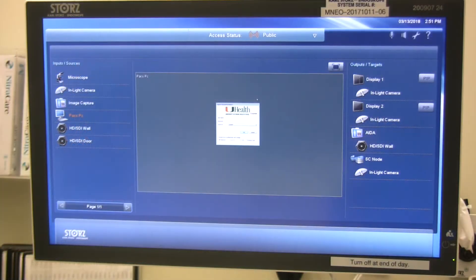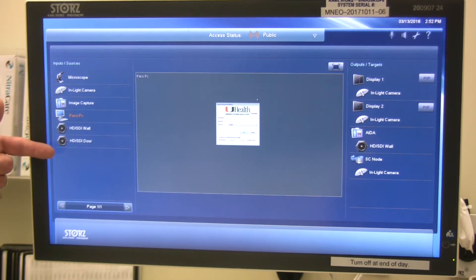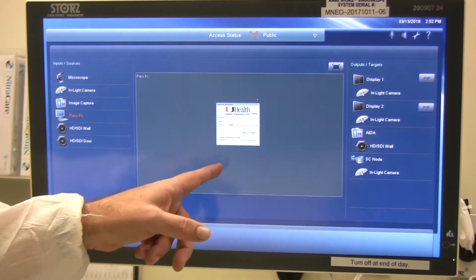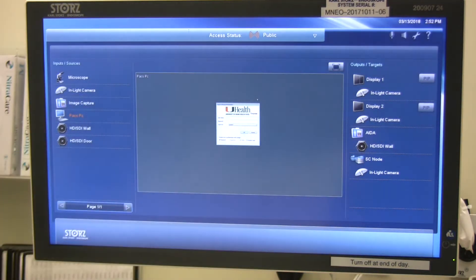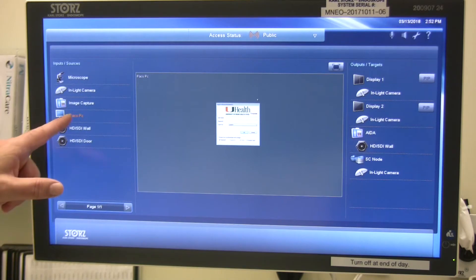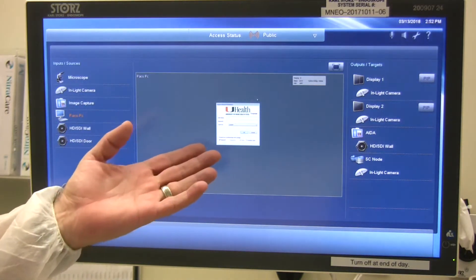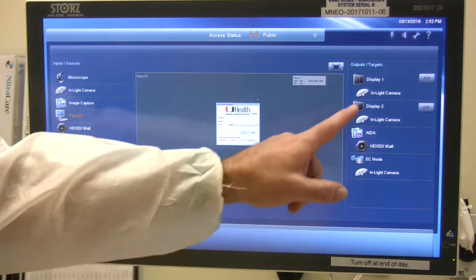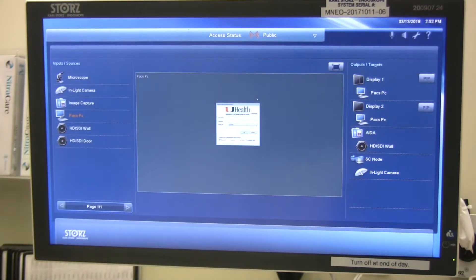Now we're going to speak to the logic of the graphic user interface on the touch panel itself. The touch panel is aligned on the left with our video sources — we have different sources we can select. In the middle is our preview screen, and on the right-hand side are our destinations. For example, if I press PAX PC, I'm going to get a preview of the PAX PC and then choose which display to send that image to, and it will route that image.